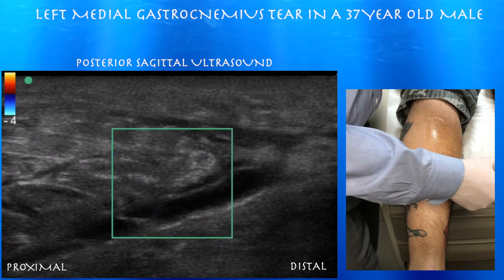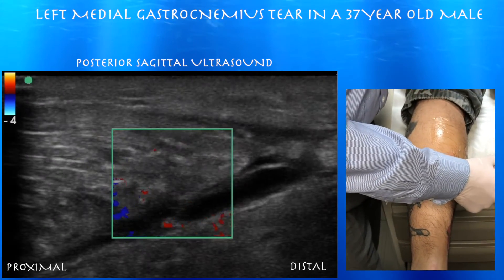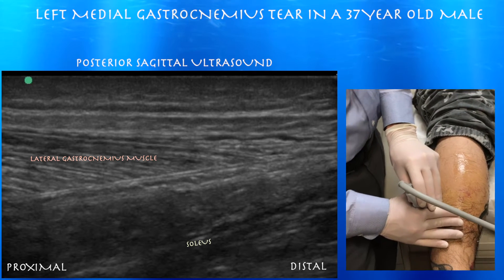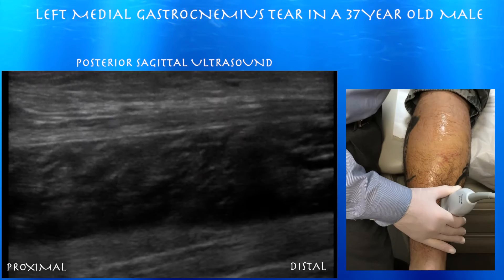You want to make sure this is not a venous structure, which color Doppler confirms — you don't see any flow in this anechoic area. Here's the lateral gastrocnemius muscle, the tip of it, which looks okay. Not seeing anything abnormal. The patient is not as tender over here — normal-looking lateral gastrocnemius muscle.